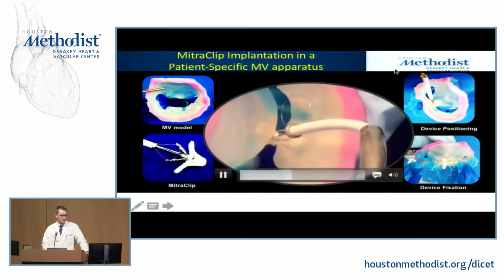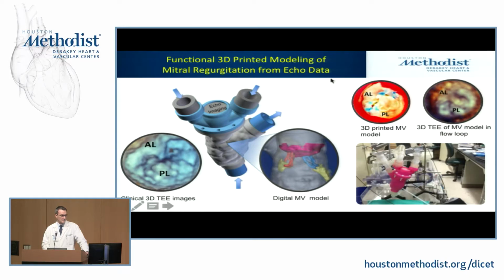It was sort of a proof of concept that it can be done. The next step is to make that even more complicated, to take the entire mitral apparatus, put it in a ventricle with an atria, and pulse flow. Try to actually replicate the patient's mitral regurgitation.